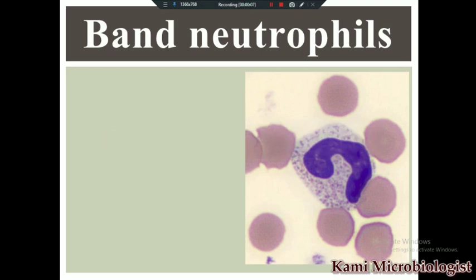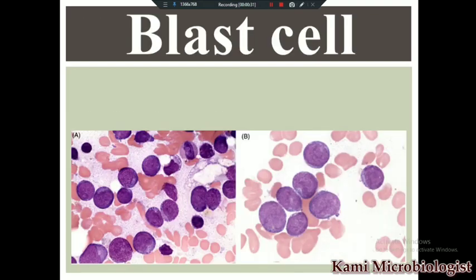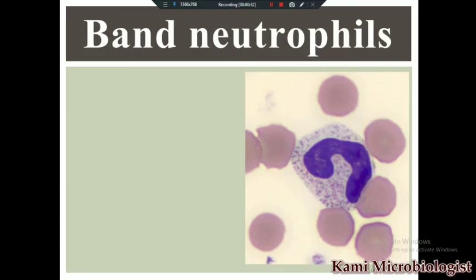So we talked about different videos in the series, and this is about the blood smear. Now this is our 6th or 7th video lecture regarding the blood smear, and in this video lecture we are going to explain band neutrophils. We are going to see band neutrophils, nucleated RBCs, and blast cells. So first of all, let's explain the band neutrophils.